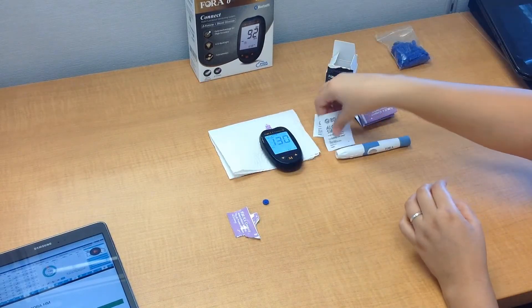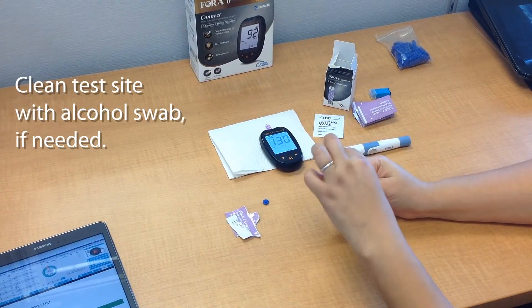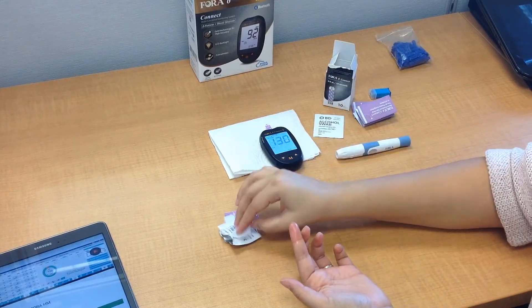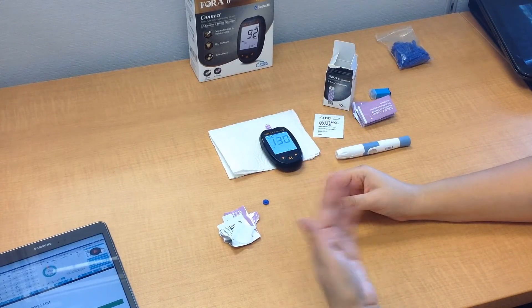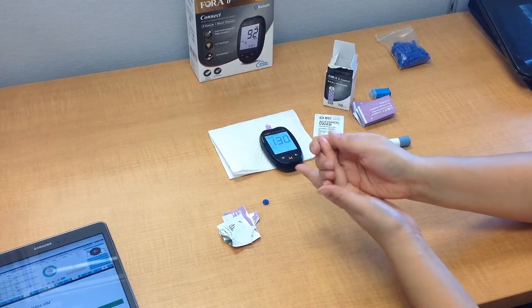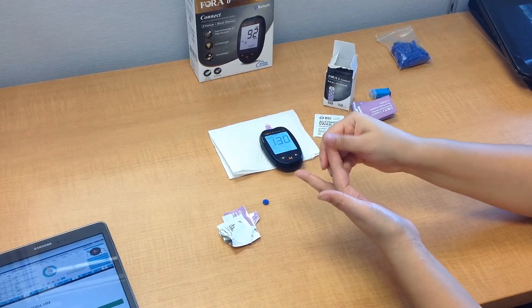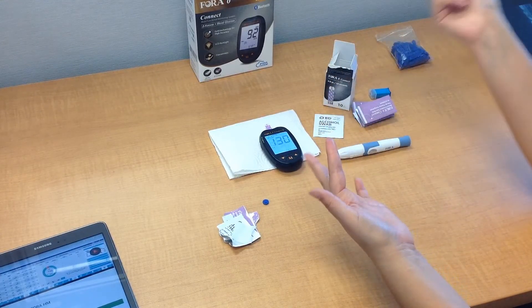Go ahead and take the alcohol swab and clean the testing site. This isn't necessary if you've just washed your hands and haven't touched anything, but if you've touched things you want to remove any contaminants — any kind of dirt, lotion, or whatever it may be. Let it air dry, and then rub the puncture site so that enough blood comes to the surface. Make sure you have enough blood, otherwise your test is not going to work and you'll have to redo it.